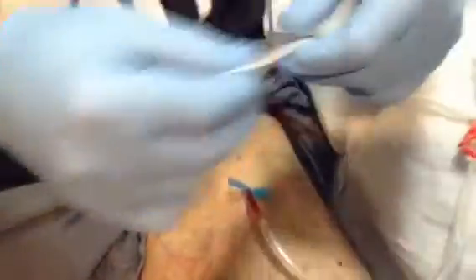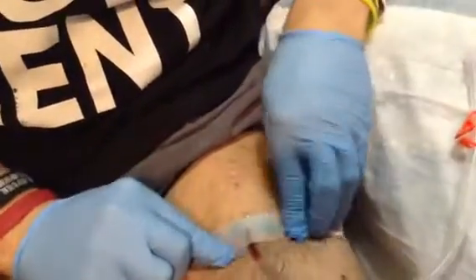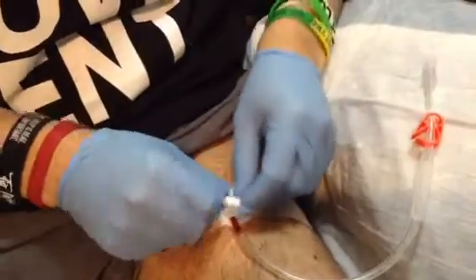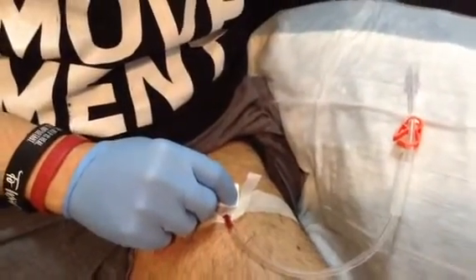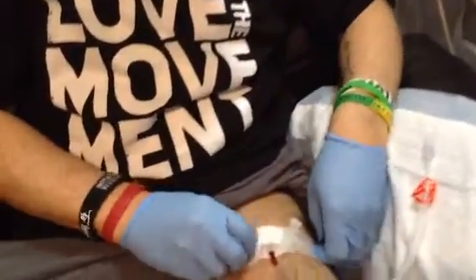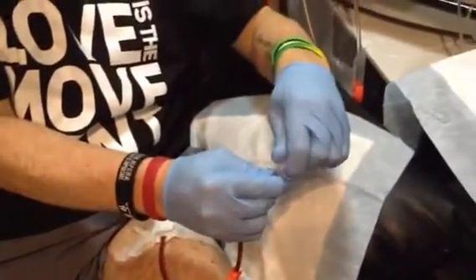I take that and I take a piece of tape and tape it down to secure it. Then I take one of these 2x2s, fold it in half twice, cover that up, and get another piece of tape. That one's all done. I take this and kind of loosen the top a little bit — you don't want the blood to come out — then close it up and clamp it.